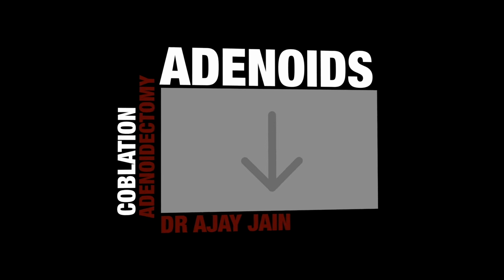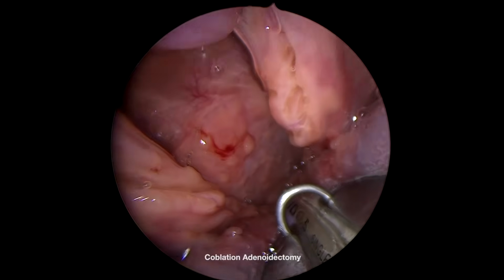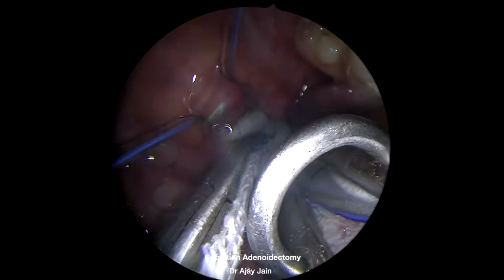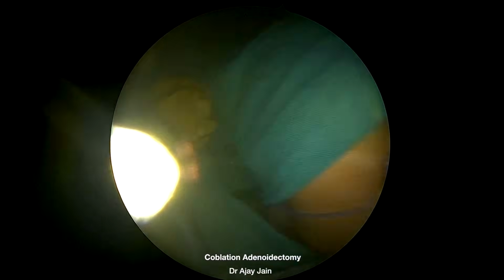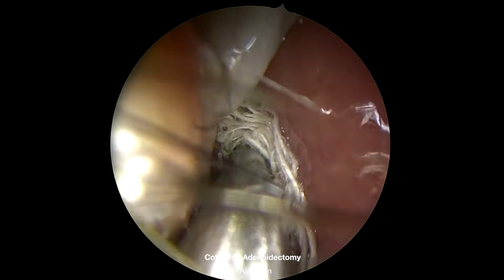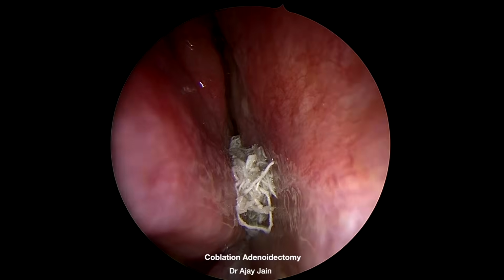Welcome to the live surgery session where we will be demonstrating the edited video of the Coblation Adenoidectomy in a 13-year-old girl. This girl has a history of chronic mouth breathing, habitual snoring, high arched palate, and dental crowding. Her lateral nasopharyngeal X-ray suggested near grade 4 adenoid hypertrophy when she was having the peak infection.